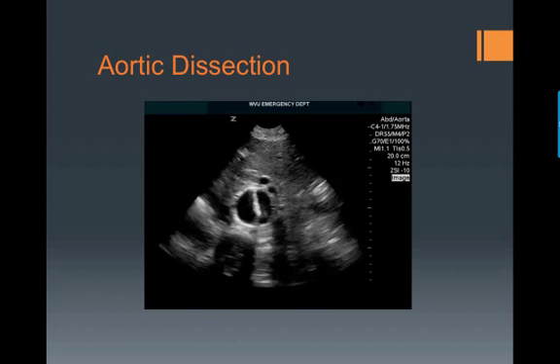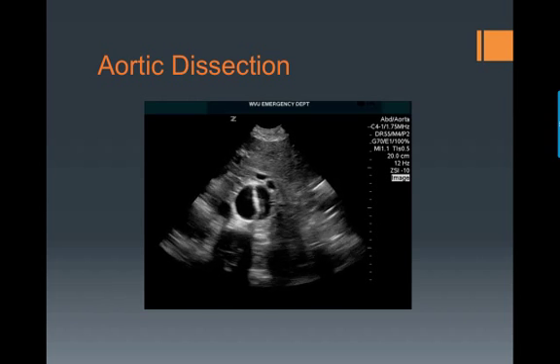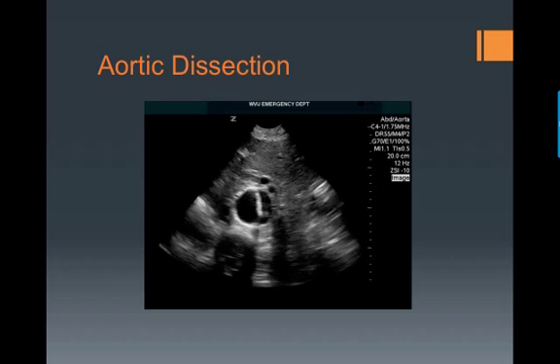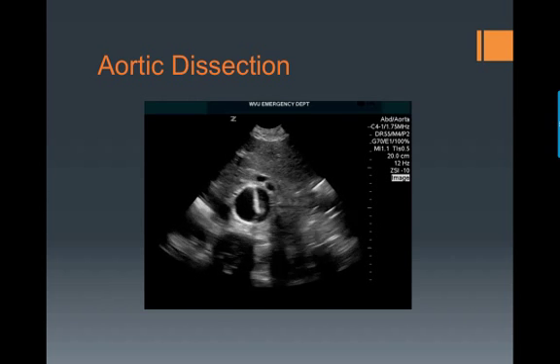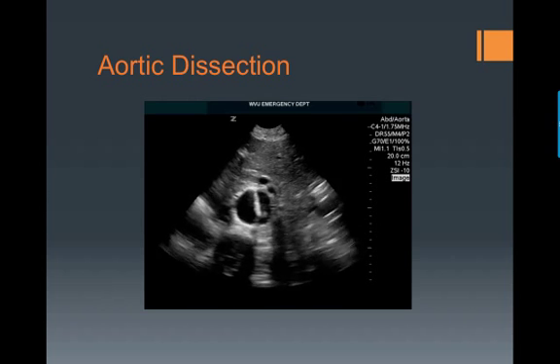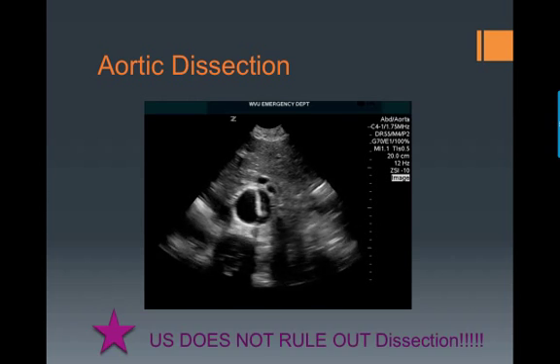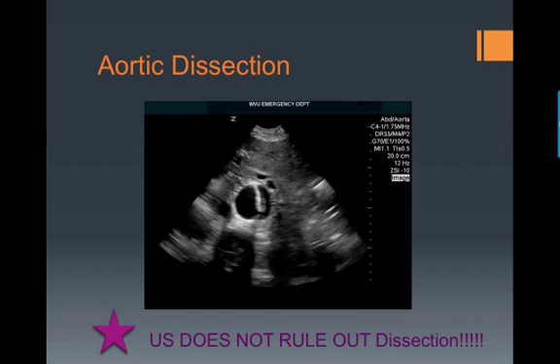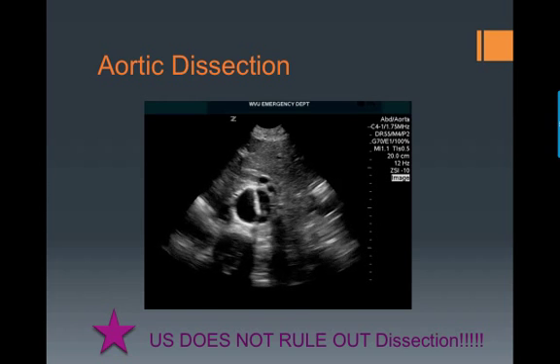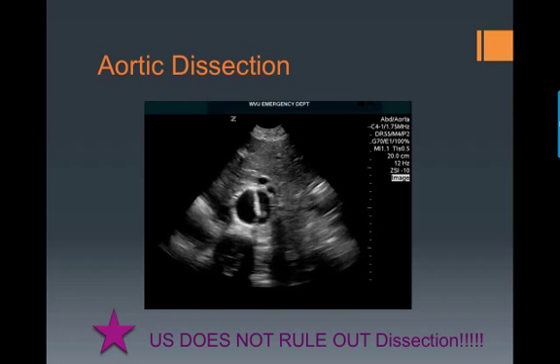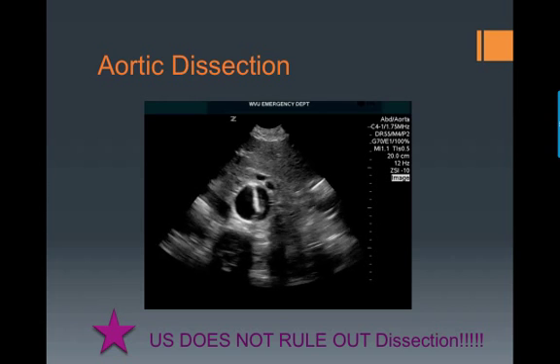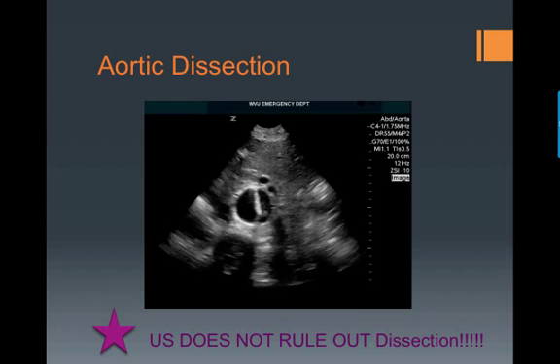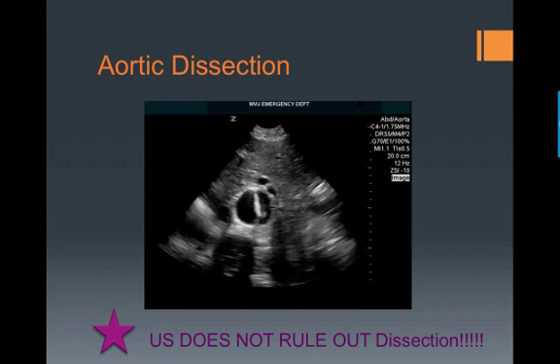This is an example of an aortic dissection. You can see the flap there in the center of the aorta. It's really important to understand that ultrasound does not rule out dissection. However, if you see this on the ultrasound image, you should be aware of what it is.